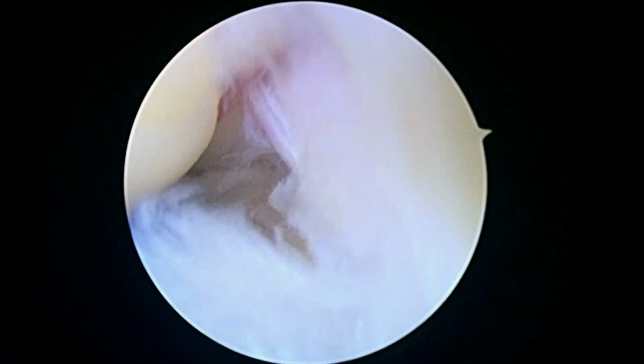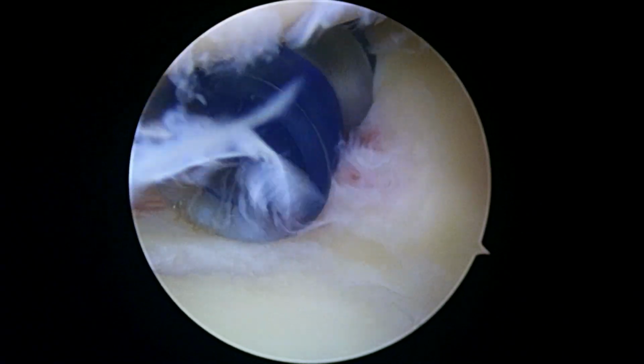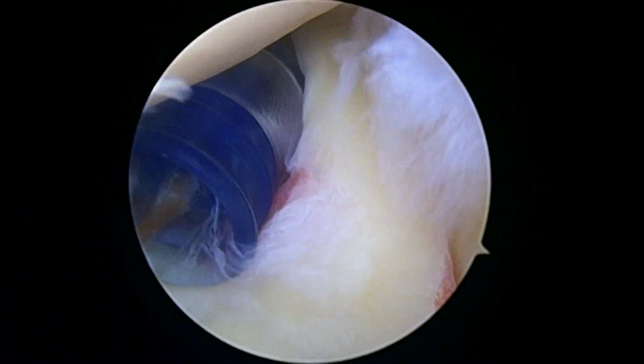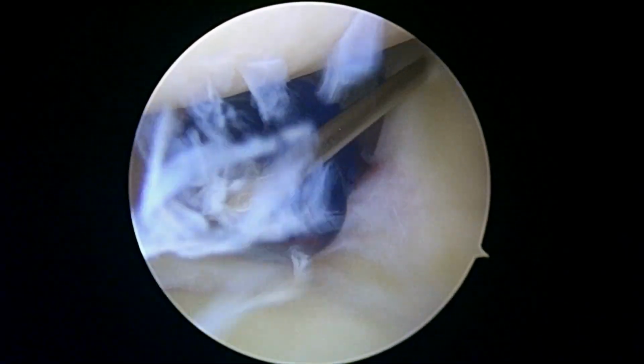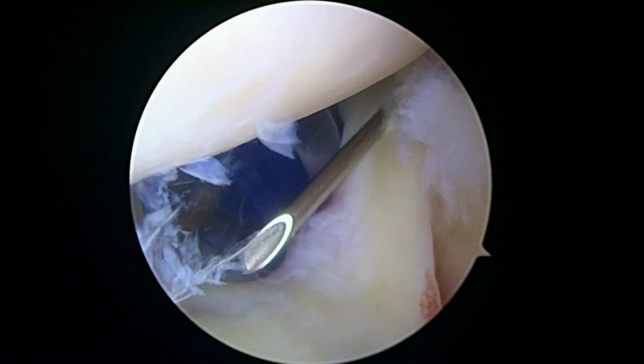Your biceps tendon is to the right of that blue cannula, and to the right of that is the rotator cuff tear. We're going to see the tear better from a different angle, so I won't spend too much time on it now. The most important thing we've got to do now is secure the biceps for you. And you can see how we pass a needle right through the middle of it. And then through that needle, we're going to pass a black wire called a super shuttle.